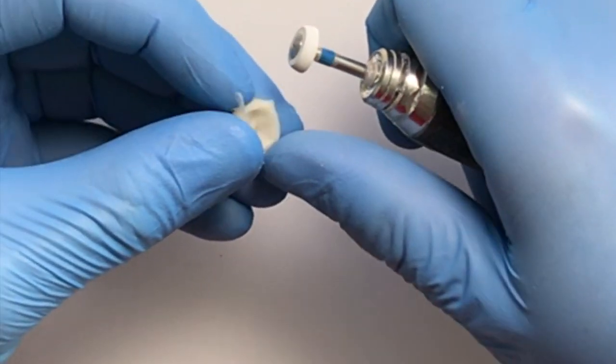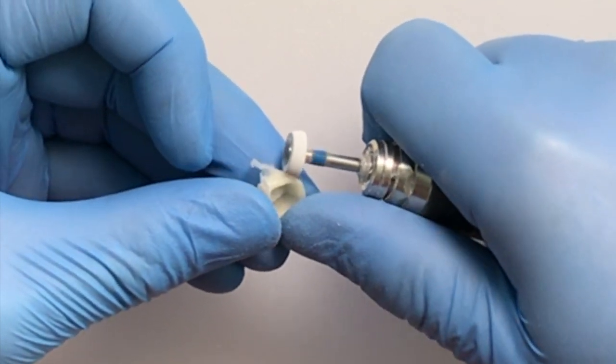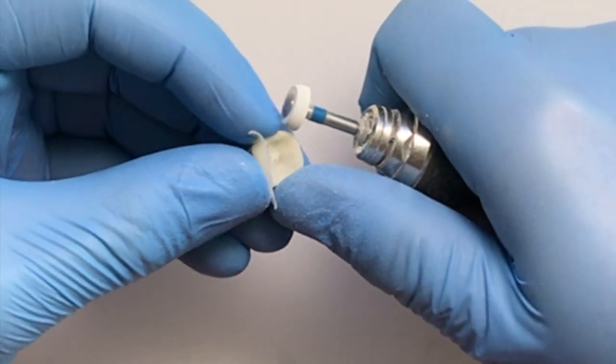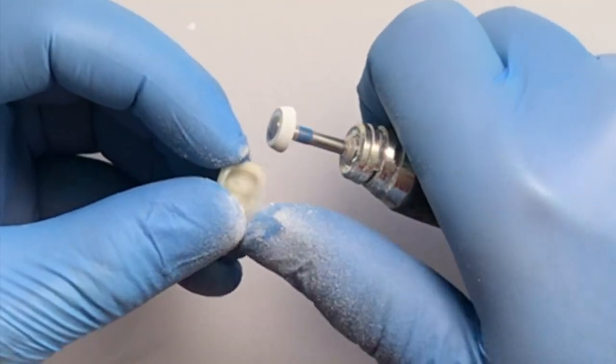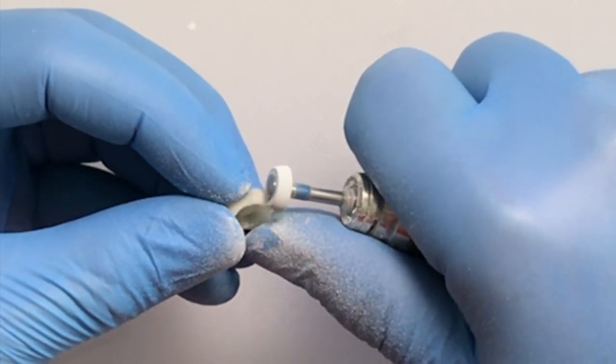Once you've done that, again, take that wheel in a mandrel and polish away. I like to polish close up to where the margin is visible, blending that end of the surface of the tooth very nicely. It keeps everything very smooth and cleansable.